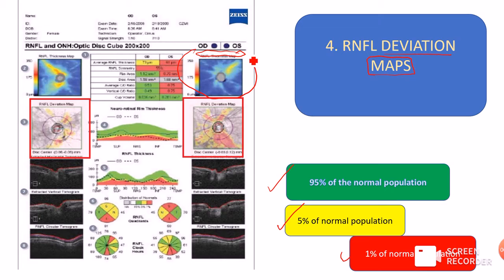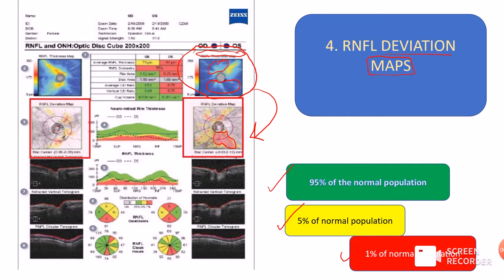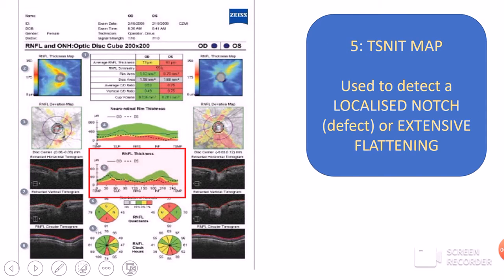It is important to note that the color coding of the RNFL thickness map is the opposite of the deviation map. In the RNFL thickness map, red indicates good thickness. In this diagram, the RNFL thickness is represented in blue, indicating thinning, and inferiorly there is no redness — it is entirely blue. The same finding is seen in the RNFL deviation map, where a large red area indicates a defect — deviation present in only 1% of the normal population, meaning it is dangerous.